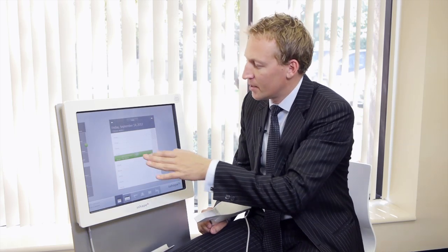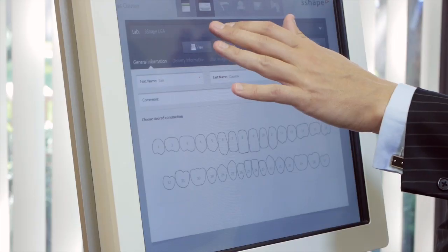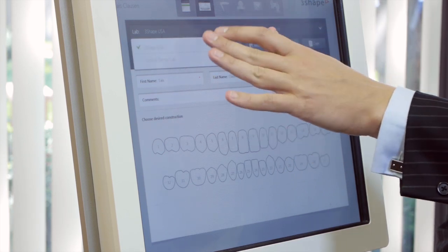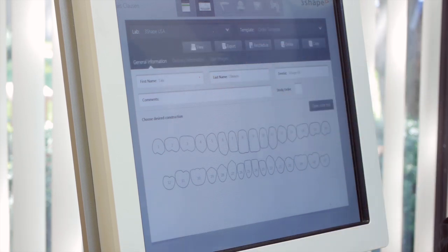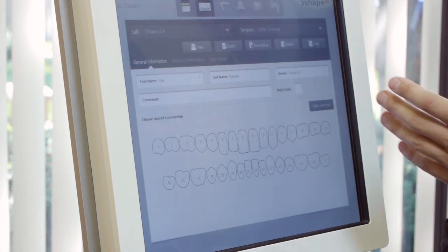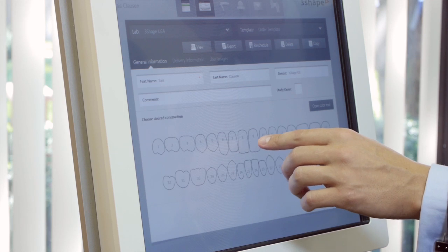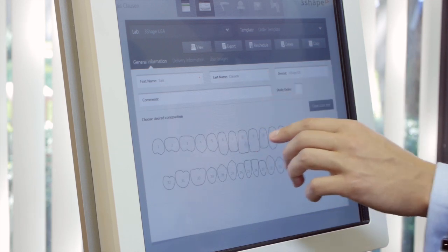I'll just walk you through real quick here. I'm going to create a new order. You select your lab up here from a list of labs that you're connected to. And really, it's fairly simple, a touch screen environment.